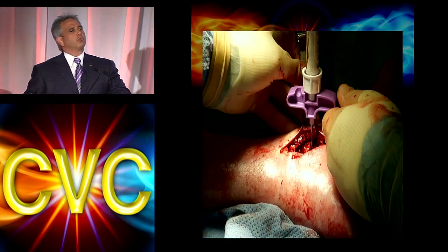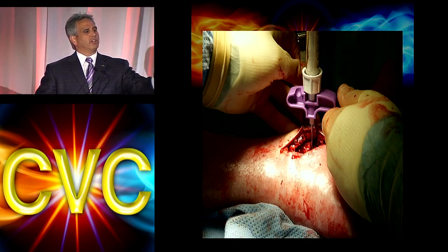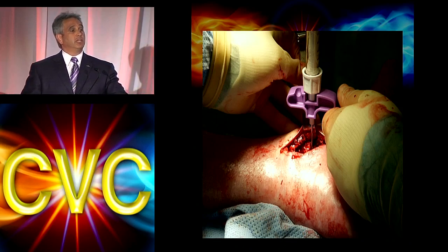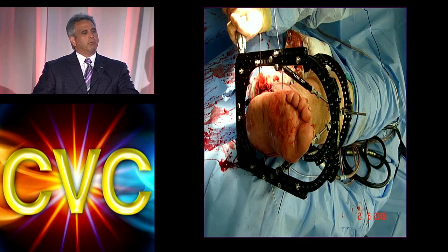And I'm going to run through this, again, just in lieu of time. Here's what we did. Got rid of the infection. So once we opened it up, once I had the infection under control, I put antibiotic beads in it, which you see me doing here. I leave the beads in for about 2 or 3 or 4 weeks or 5, and I simply take them out.